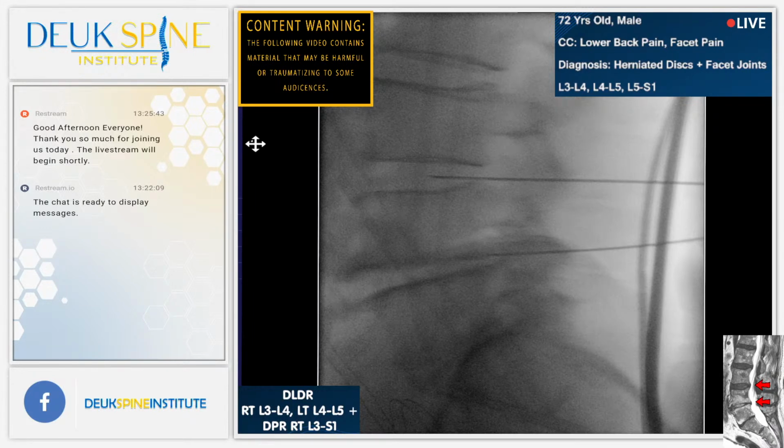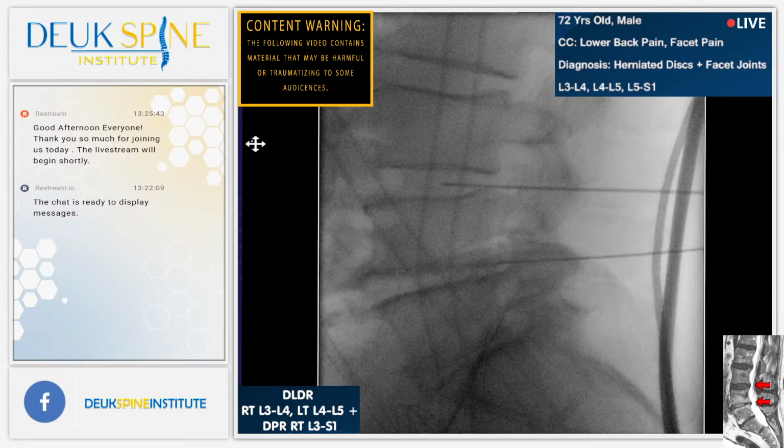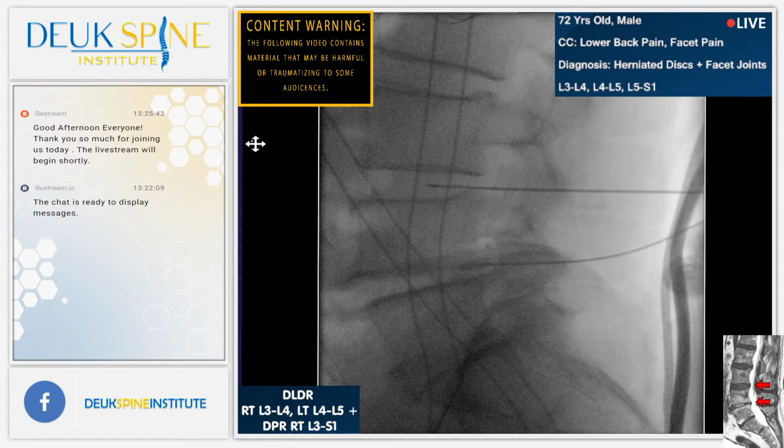Really hard. You doing all right? Where are you having discomfort? Where's your pain? In the back? Interesting. The facet complex is forcing me just to the end plate. So it's hard for me to get further south. Shot? Yeah. He's not liking that. Let's see if I can get a little bit further south. Shot?